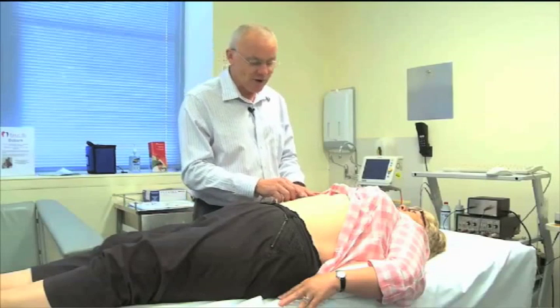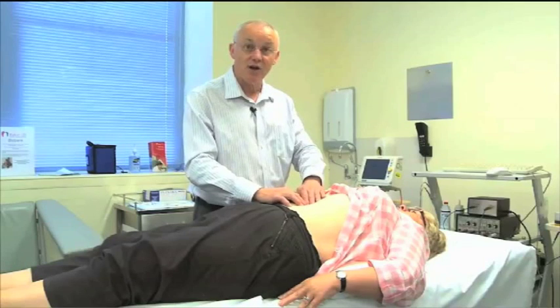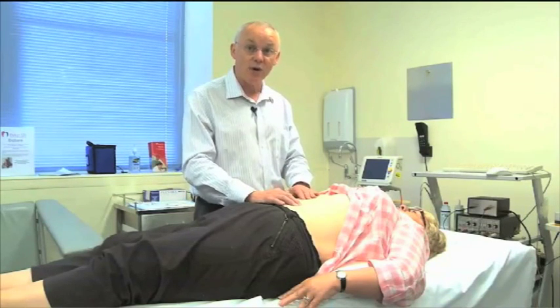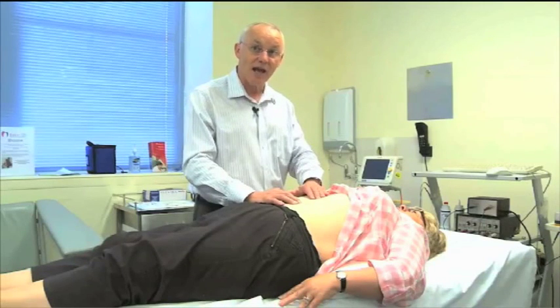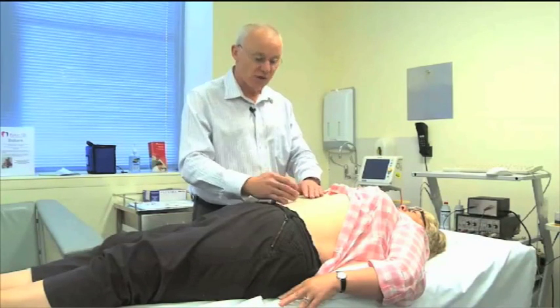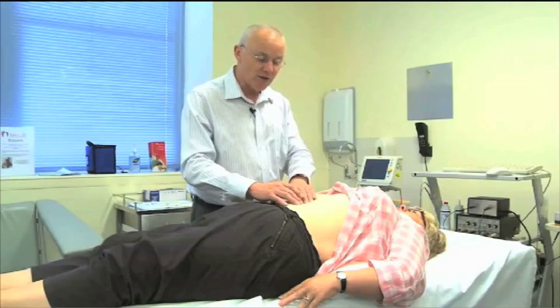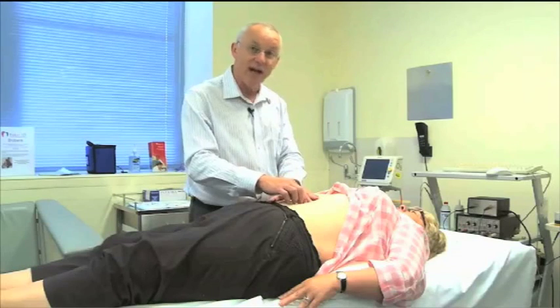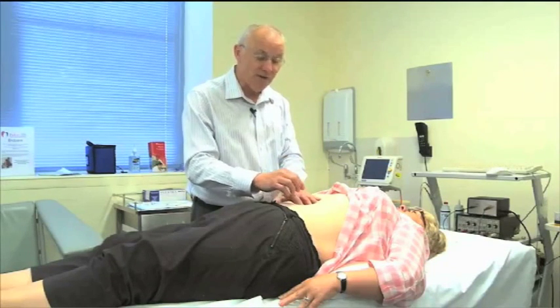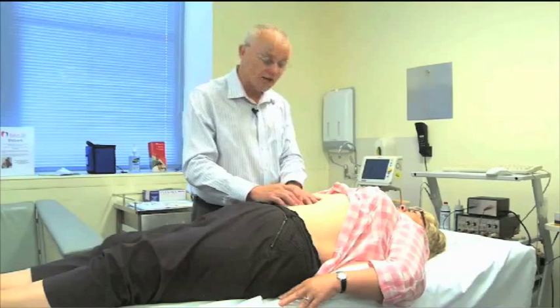If the port's difficult to feel, we know that it's in relation to this larger wound here and it's usually just below. I can feel it easily here. If there's any difficulty finding the port, we don't want to hit the tubing as it's coming out of the reservoir. We want to always go from the opposite direction — if the tubing is coming up here towards the band, we want to make sure we bring our needle from underneath. So I can feel this port, I can go directly, but if there's any doubt I'd go a little bit below and walk up onto the soft part of the port.